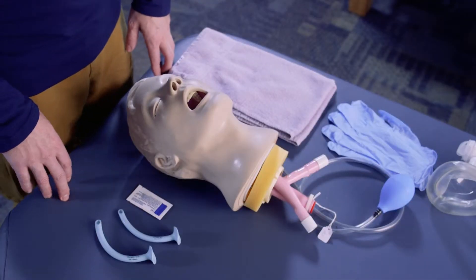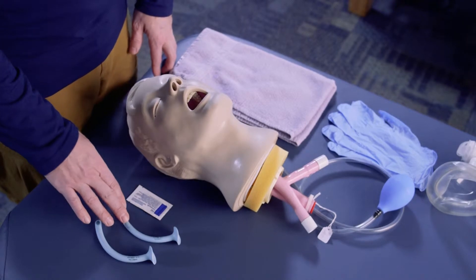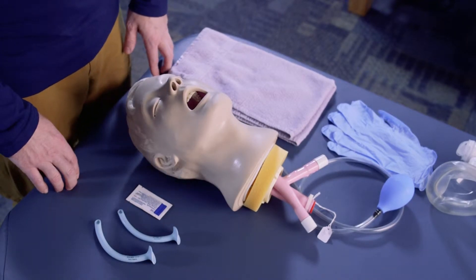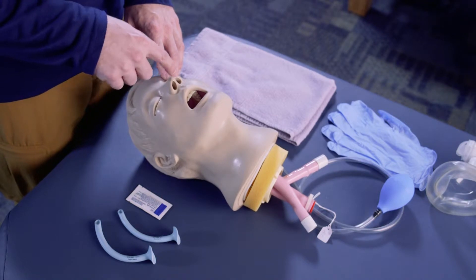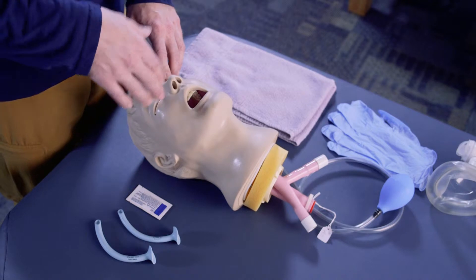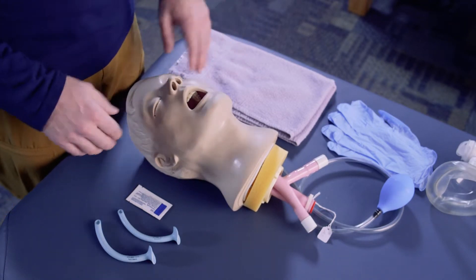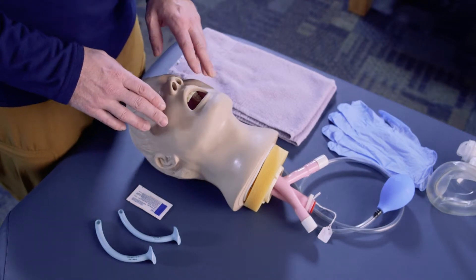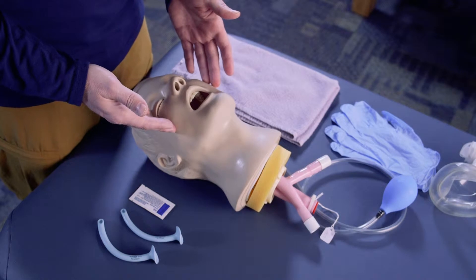The technique we're going to demonstrate here is inserting a nasopharyngeal airway, otherwise known as an NPA. It is a tube that goes into the nostril and back down into the throat to create an airway. This is a secondary airway used when the primary airway — the mouth — is not open.